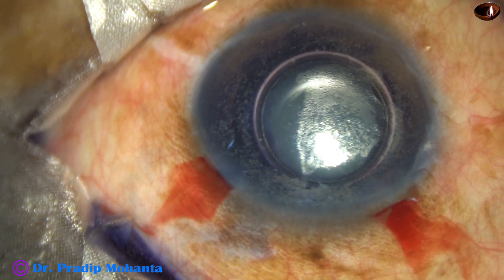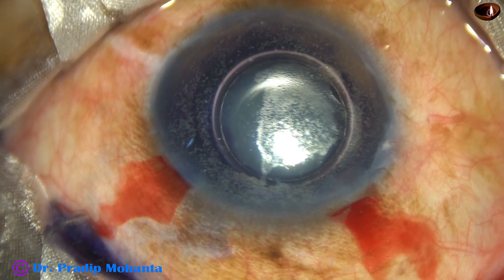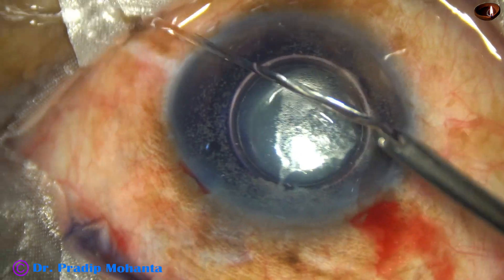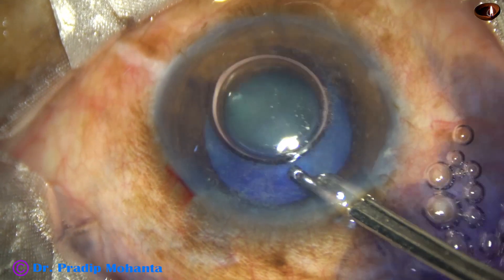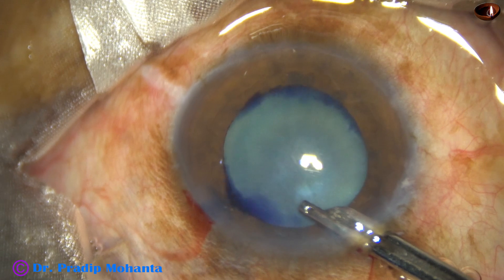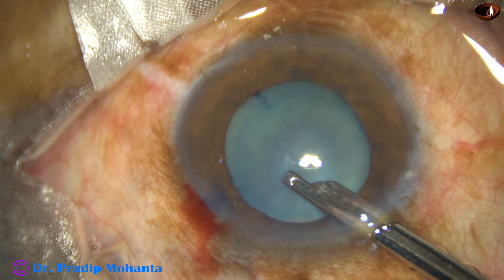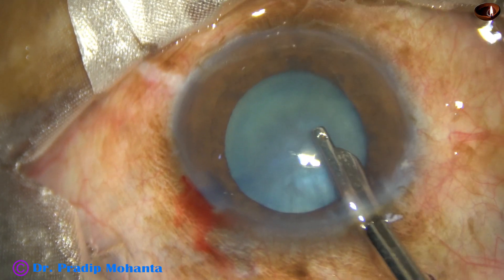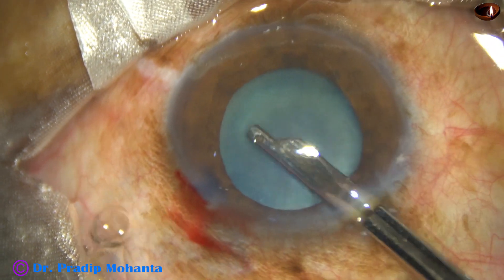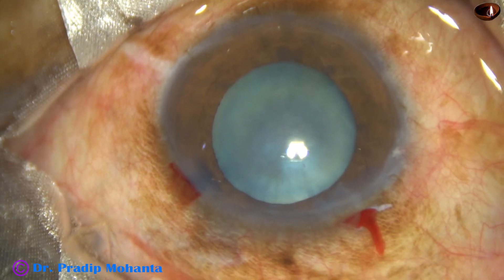I have injected a bit of adrenaline to see if the pupil dilates a little more. This is a mid-dilated pupil. And this is the anterior chamber lavage with BSS. There is a lot of dye which is behind the iris — it is coming out. And now, capsulorhexis.